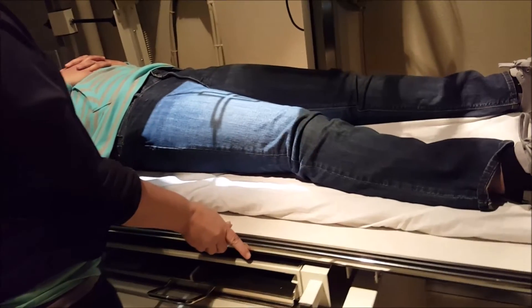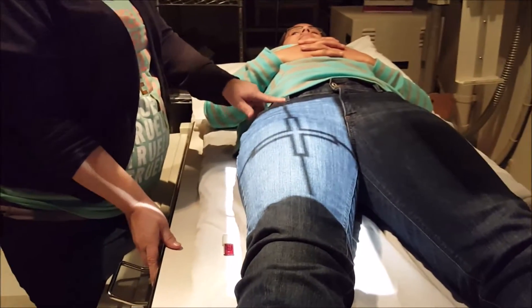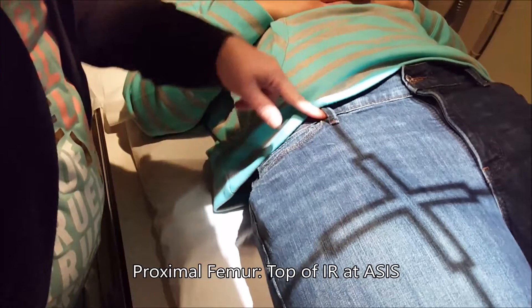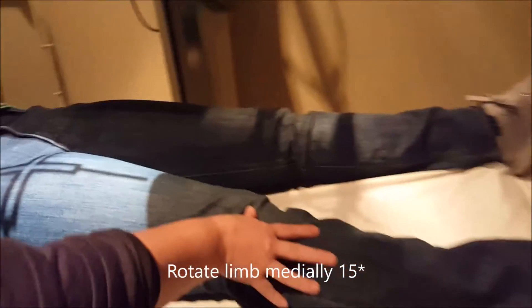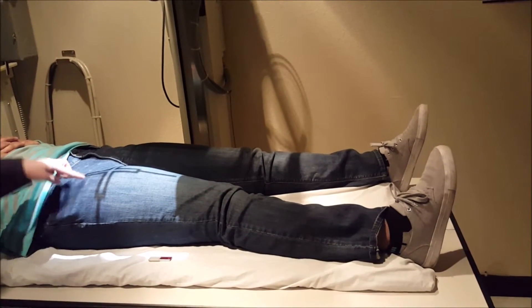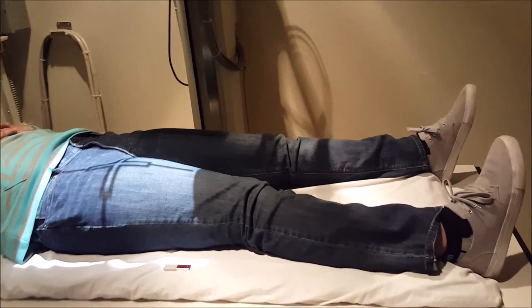We're going to center our femur — there's no real specific centering point for the femur. We just need to have the top of the IR at ASIS, so that's about right here. I'm going to have the centering run right down the patient's leg. We're going to have the patient rotate their limb in about 10 to 15 degrees so that we get the greater trochanter in profile and elongate the neck.